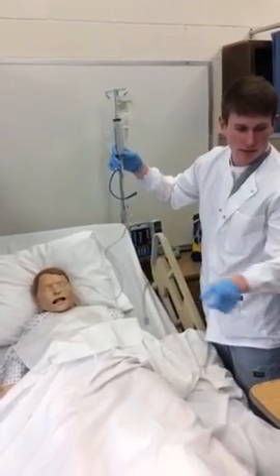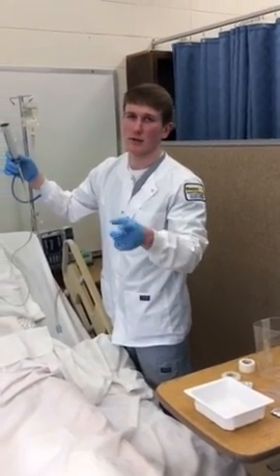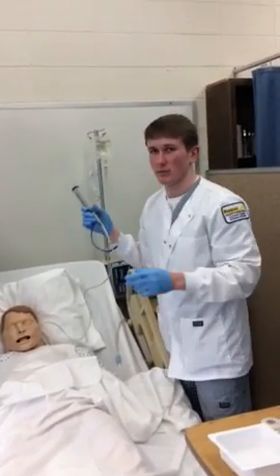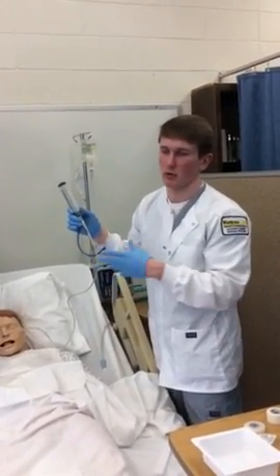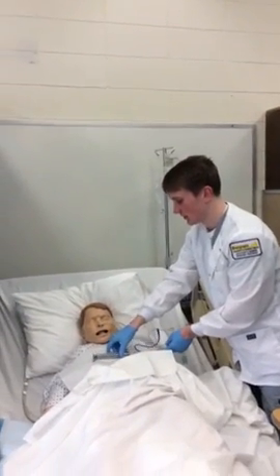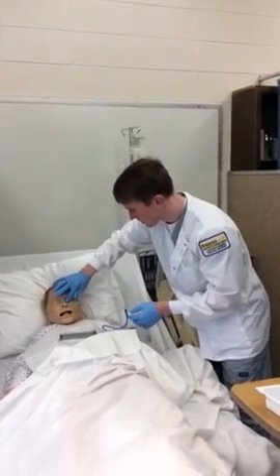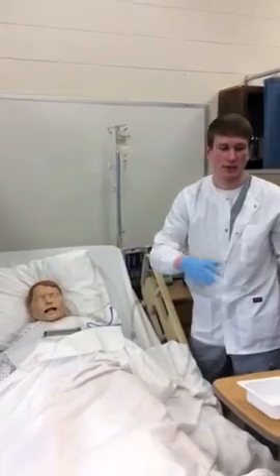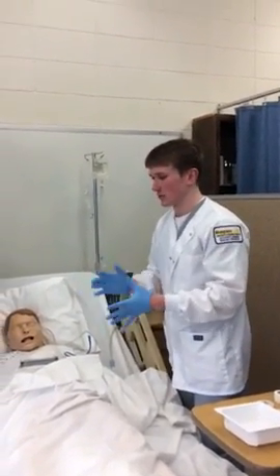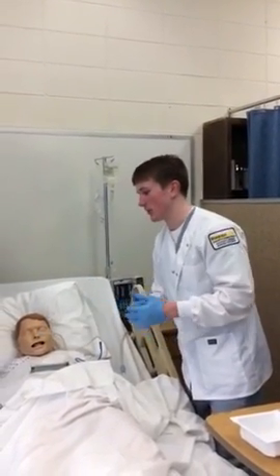So now that I've done that, and the pH, if it's 0 to 4, that indicates gastric placement, and if it's 6 and above, that indicates lung or intestinal placement. And I'm also going to be looking at the color and consistency as I pull that aspirate out as well. And now to finally confirm the placement of the NG tube, I'm going to get an x-ray for them. And if I have to leave and come back, I'm just going to repeat the same process and look at the aspirate and the respiratory complications to make sure it's still at the correct site along with the tube marking I made.